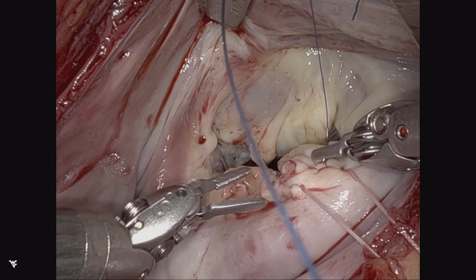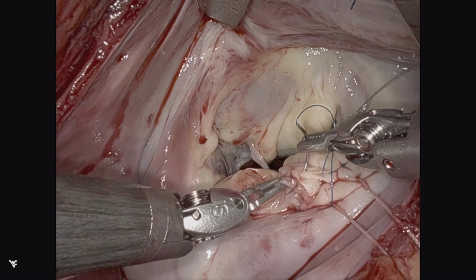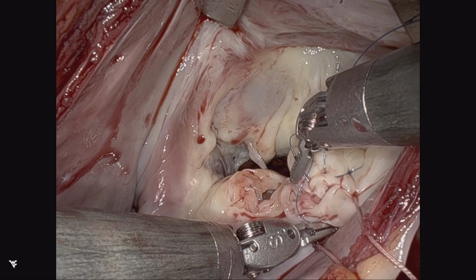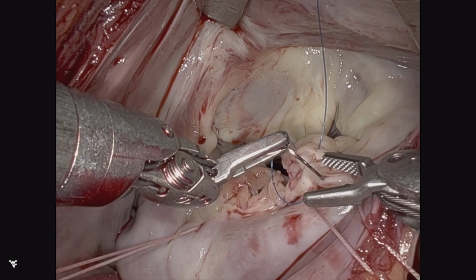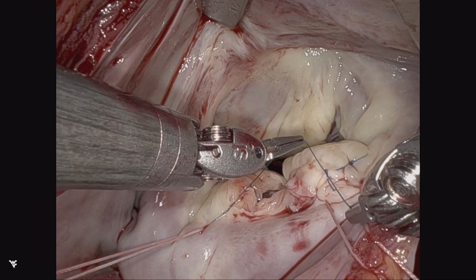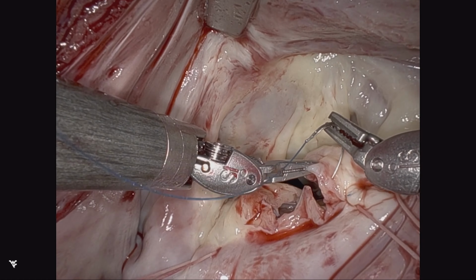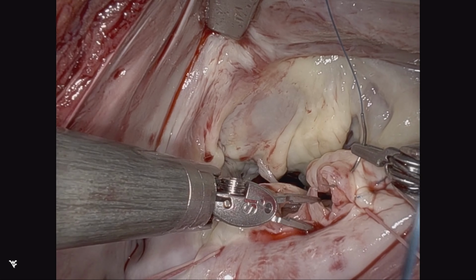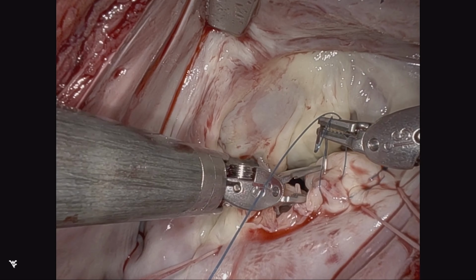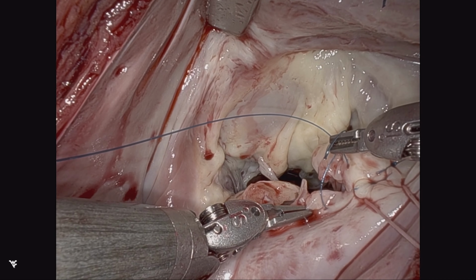And again, marching that P3 and edge of P2 leaflet closer to the midline, which in effect does reduce the posterior leaflet height quite substantially. Again, small bite on the leaflet side, larger bite on the annular side in order to get that height reduction and the effective slide.